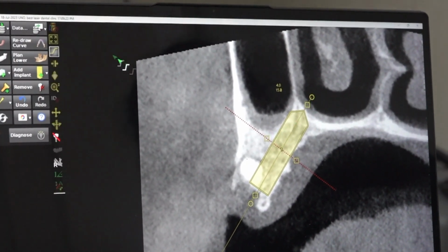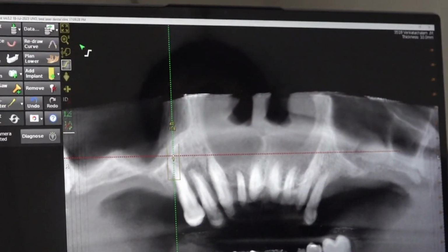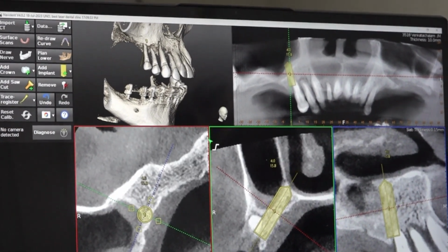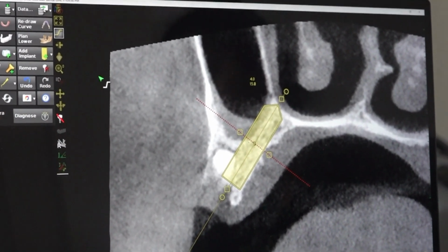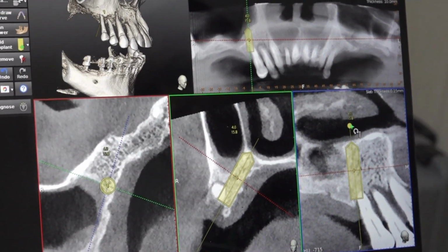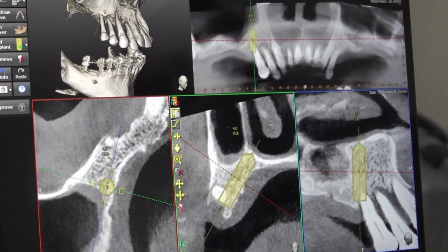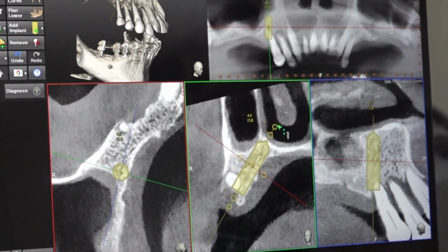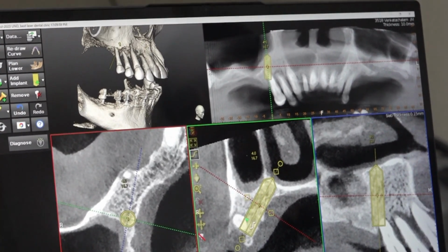Okay, if you see, I have placed only the axial. We have not tilted mesially and all. I'm just tilting distally. Okay, if I'm tilting distally, it is into the sinus. Okay, now I am slightly tilting mesially. The more I am tilting mesially, you can see it is in the good quality. Even you can refer the nasal here. The bone's quality is good.